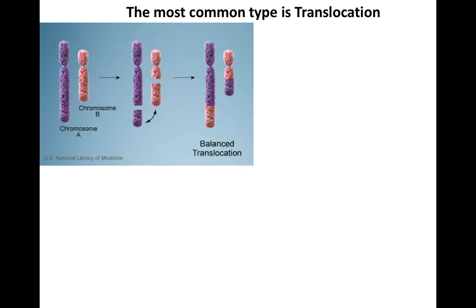The most common type of structural chromosomal abnormalities بنشوفها بتبقى الترانسلوكيشن. الترانسلوكيشن دي بتعتبر the commonest type، وخصوصا في الكانسر، في الهيماتولوجيكال malignancies زي leukemias and the lymphomas. Okay, this is an example of what? It's a reciprocal translocation. As you see here, break there, and exchange of segments. So you will have balanced translocation between these two chromosomes. No gain and no loss of genetic material.